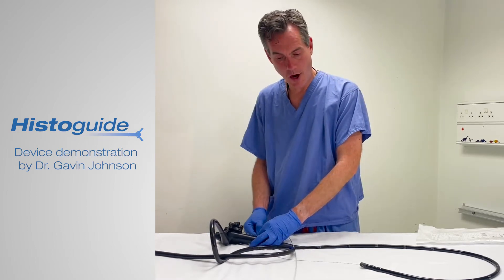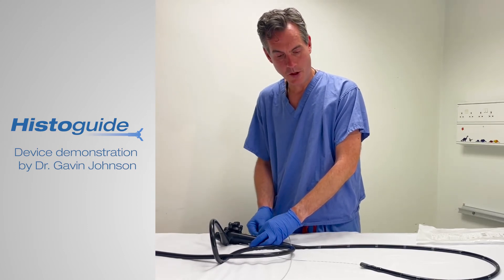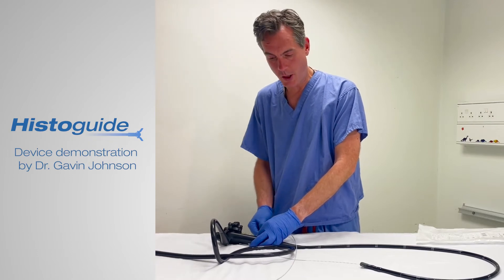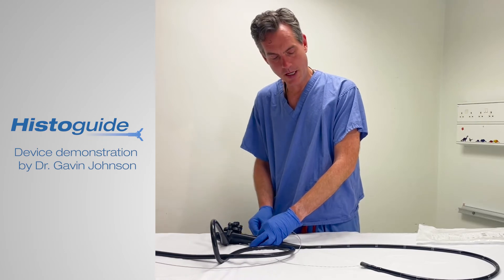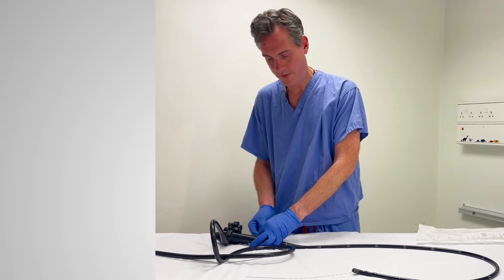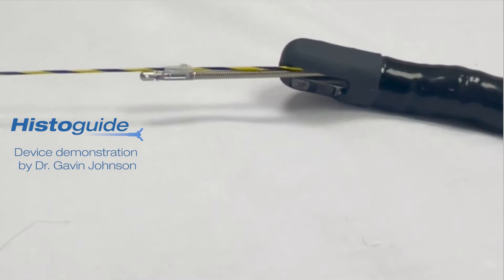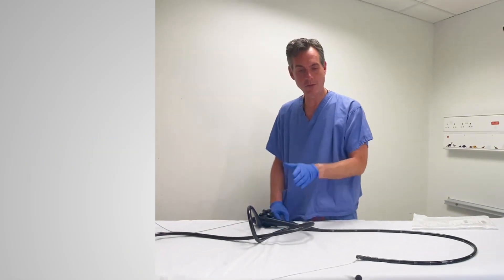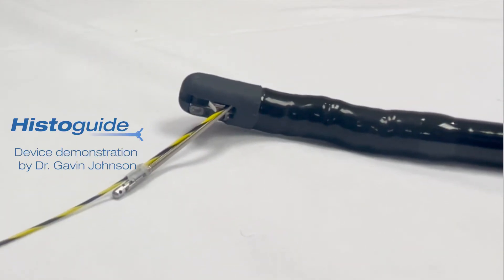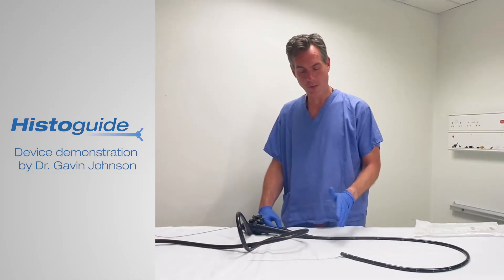We're going to have our elevator off at this point — let me just double check that's the case — and we're going to get them out of our scope. We're looking at our luminal view at the moment. You'll feel them touch against the elevator nice and gently. Now elevator off, have them exit the scope, and then elevator on. They are wire-guided, but you need to be aiming up towards 11 to 12 o'clock of your prior sphincterotomy — you're probably going to want to have done a sphincterotomy for this, as well as with the infinity brush.